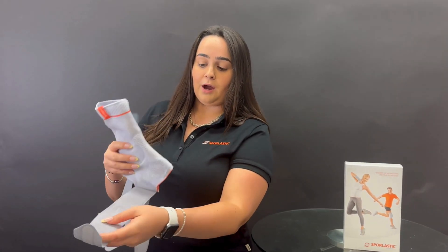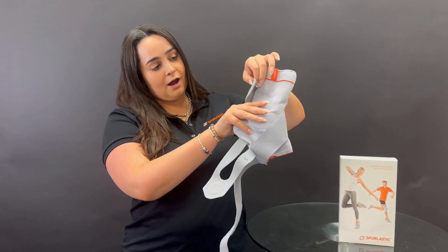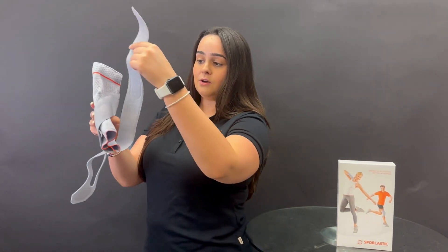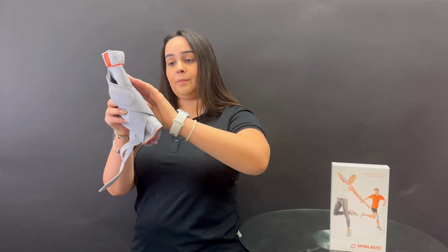So this is strap number one — it always goes over the ankle and then around the back to the top. You take number two, same process: over around the front of the ankle or the talus, and then around the back.